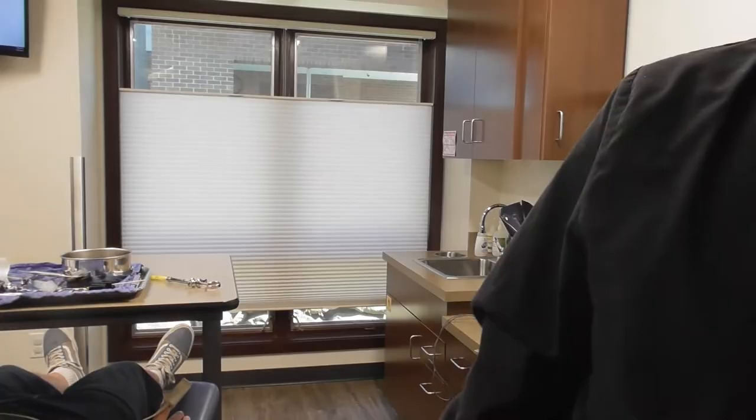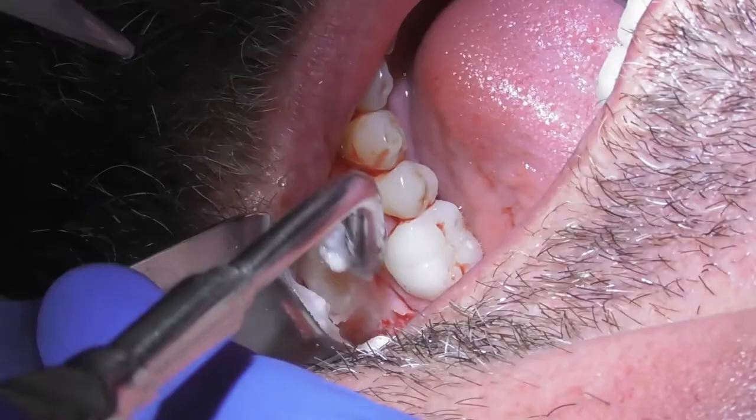So we just got rid of this lump of bone called an exostosis. These exostoses — sometimes called tori depending on their anatomical position — are dense cortical bone and are variants of normal, not pathology. We didn't biopsy or send anything off to the pathologist because we don't need to — we know what it is. With the drilling procedure you can see that fine white dust: that's just bone being removed. Made sure it's nice and smooth, stitched it closed. He should heal very well — soft cool foods today, soft warm foods tomorrow, ramping up based on comfort.